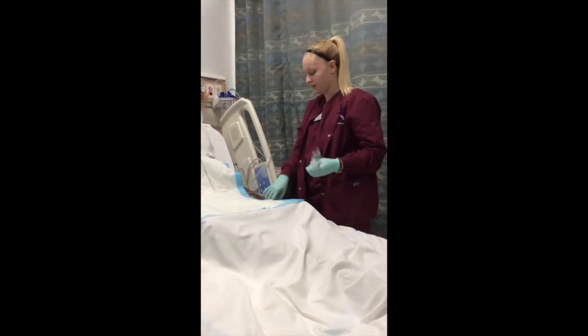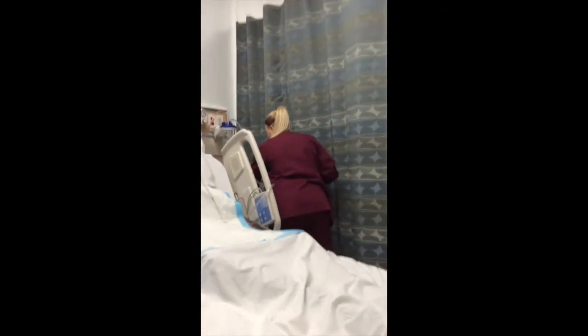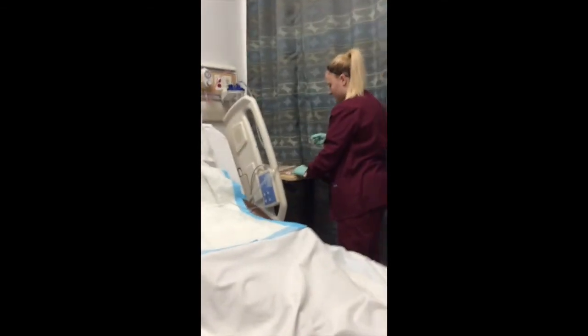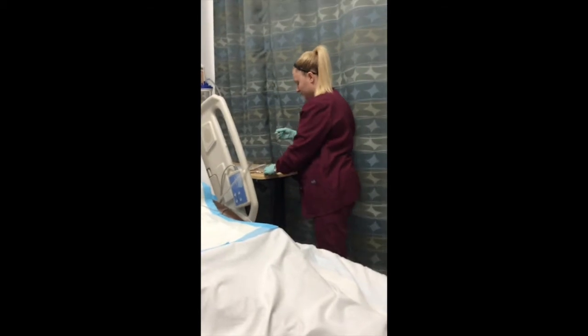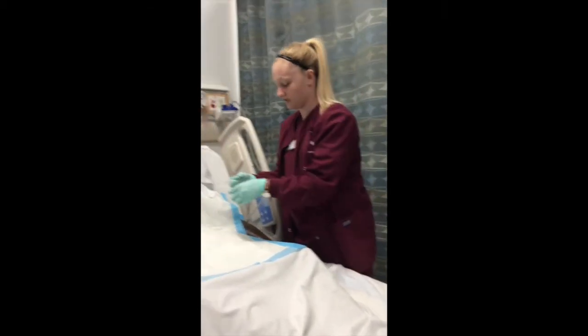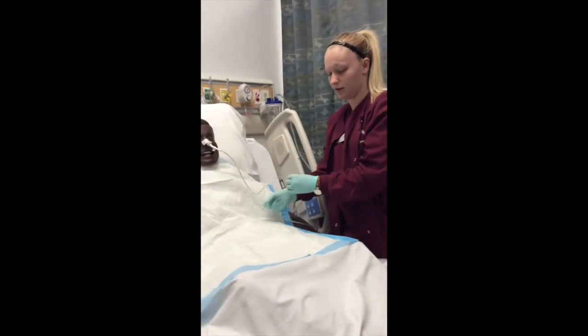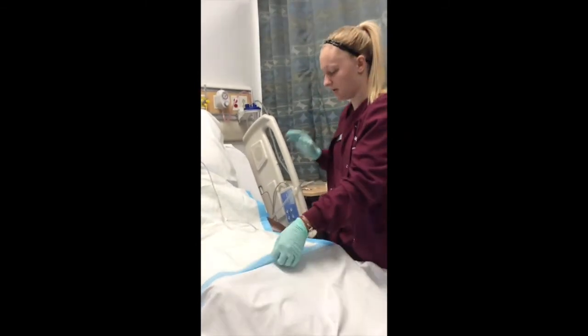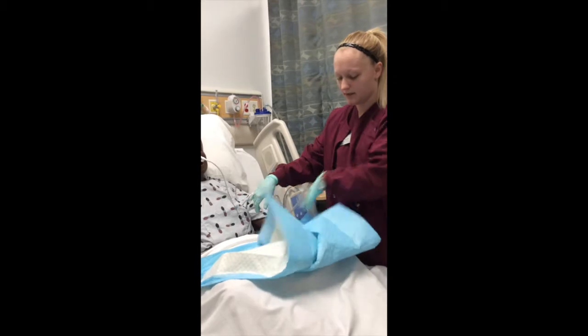Alrighty, so after that, I'm going to go ahead and get my pin and my rubber band. I'm going to take that and get it onto their gown. I'm going to put the rubber band around it and pin it onto their gown. And I'm going to go ahead and clean up my work area.